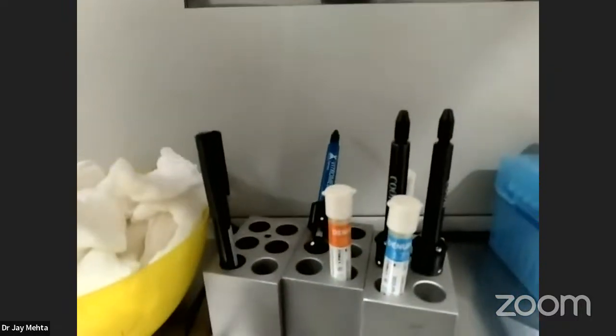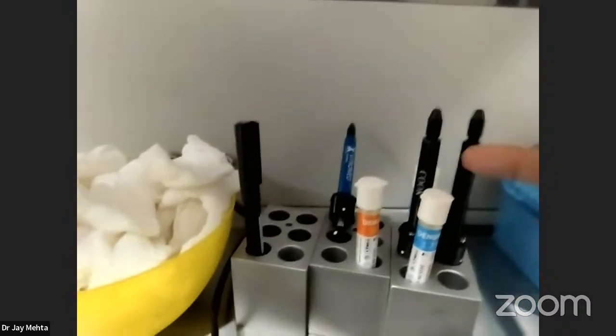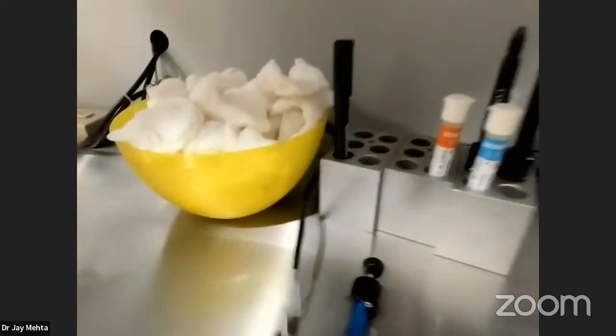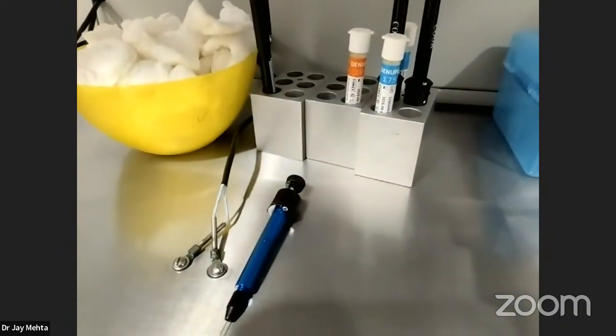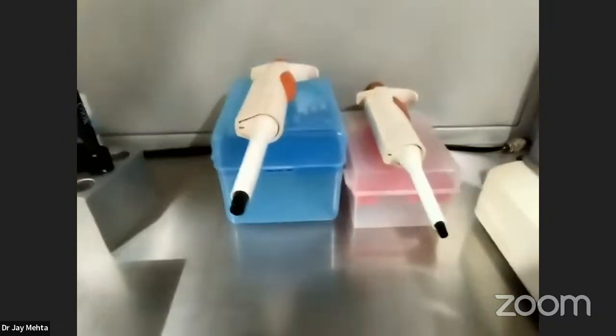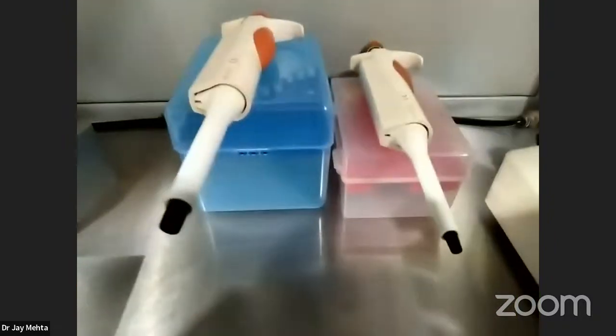See, I'll just show you. It's such a comedy thing. Everybody has their own pipette here. This is Ankita's. This is Asha's. This one is Chitra's. They've kept nothing for me. Everybody has their own manipulation pipettes, their own micropipettes, and their own tips which are present here.